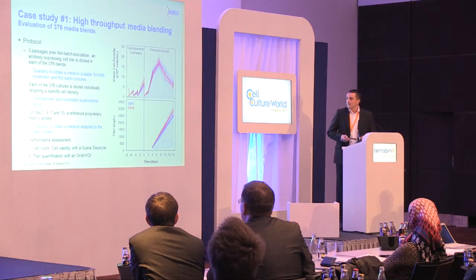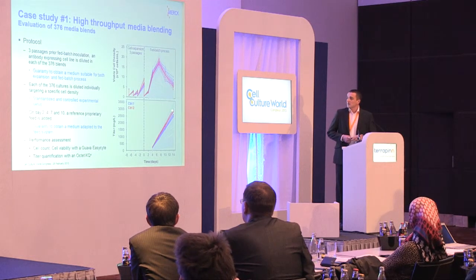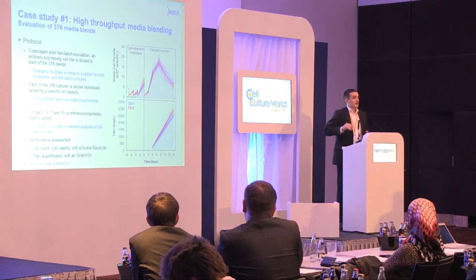Here you have 2 controls. In blue, it was our 3rd generation proprietary medium. And the second control is one of the 16 formulations. It is a formulation where all the components are at the mid-level.